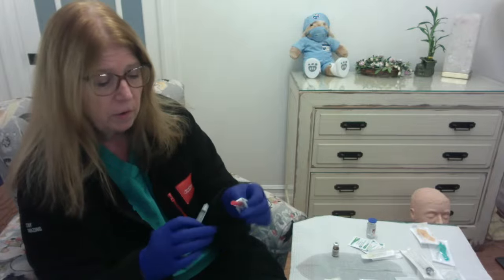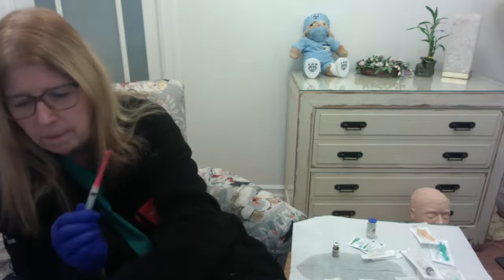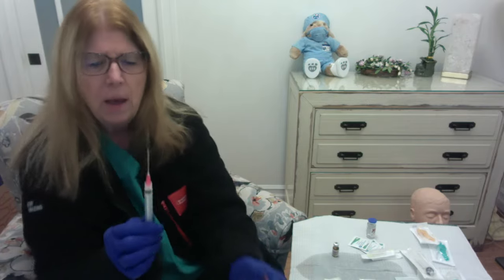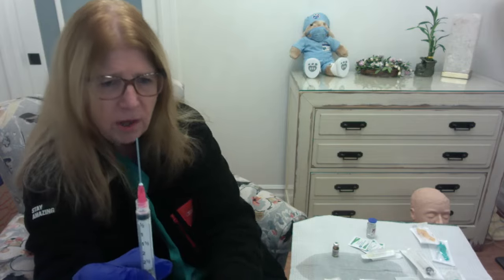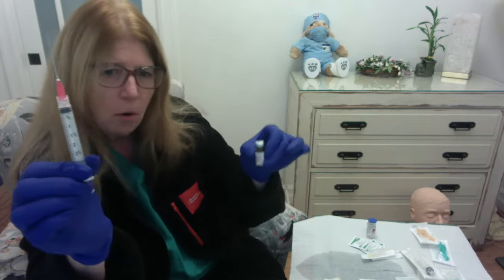So I'm going to open this up, and I'm going to put these two pieces together by twisting them together. And then again, I'm just going to pull off the cap. I don't know how well you can see, but there is no bevel to this needle. It is a blunt top needle, kind of just squared off at the top.